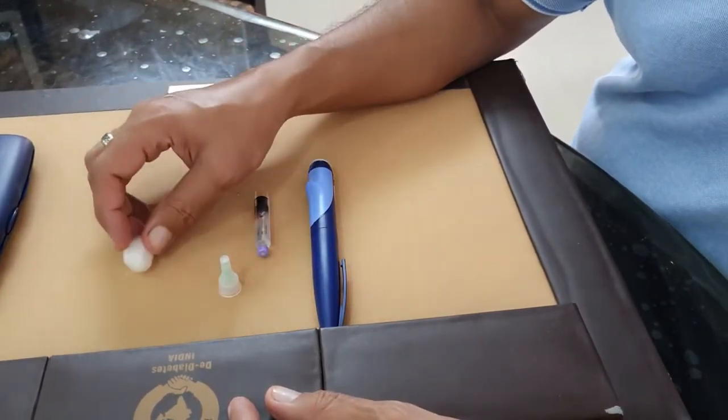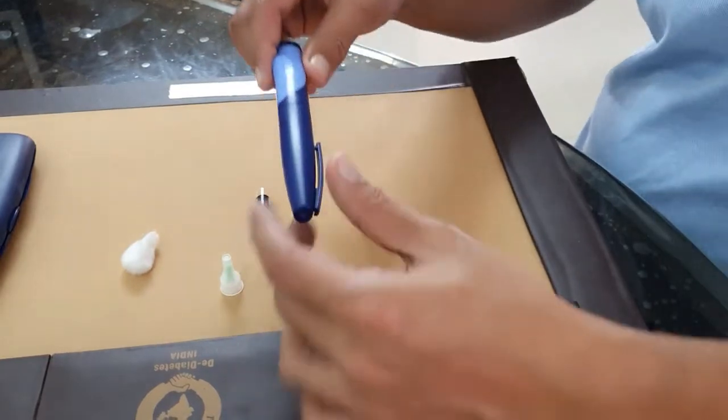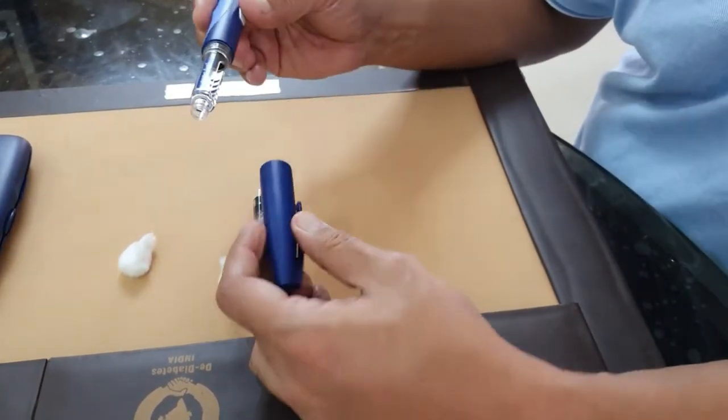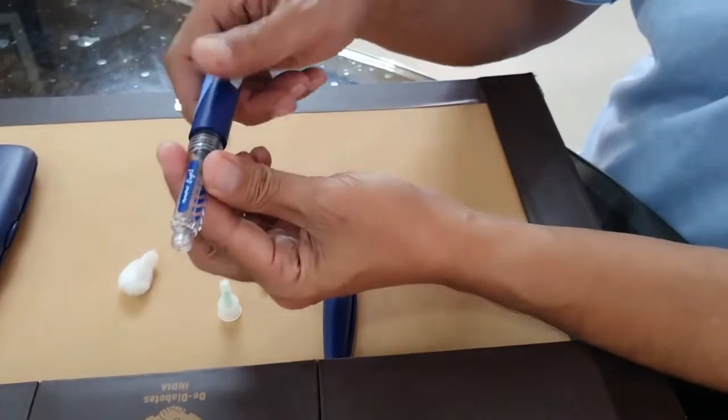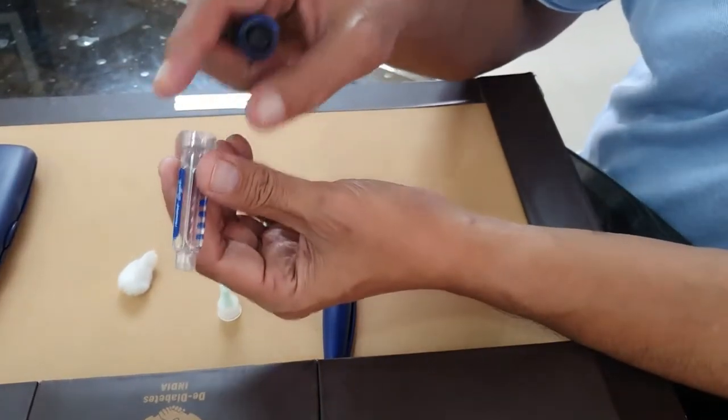Once you get the pen it will look like this. It has a cap and a cartridge box you can remove like this. This is the area where you're going to put the cartridge.